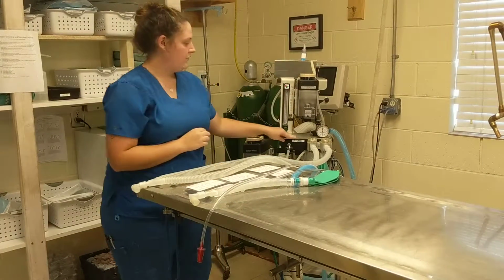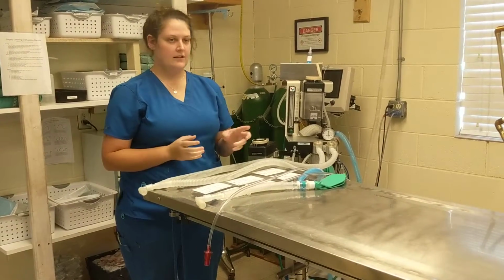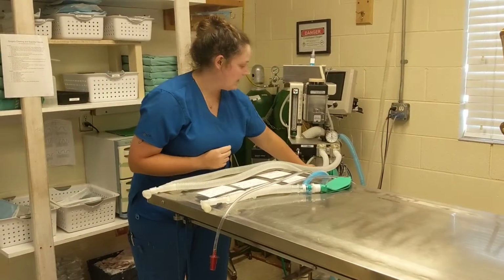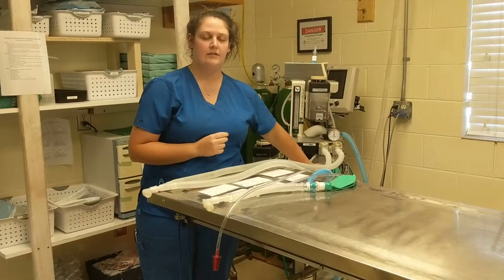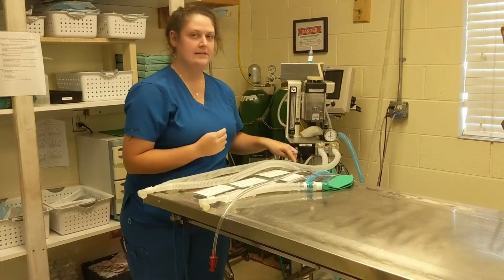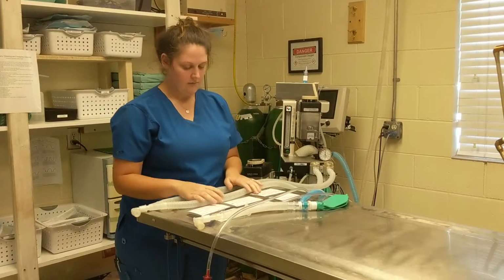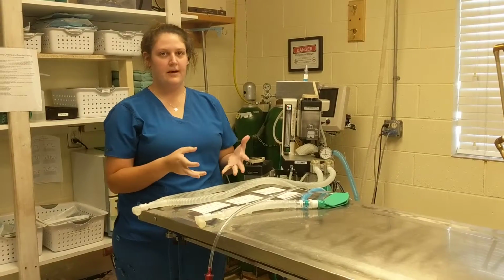After it goes through there, when the patient exhales, the CO2 can collect. In this machine, it collects in this canister, the CO2 canister, and then it goes through to our passive system that is vacuumed out through this port. Now that we've done that, we get to see the effects on the patient.